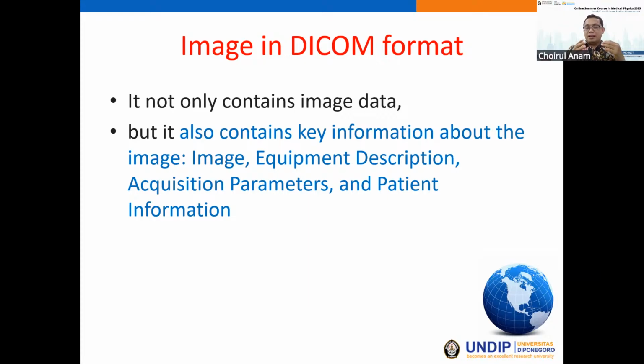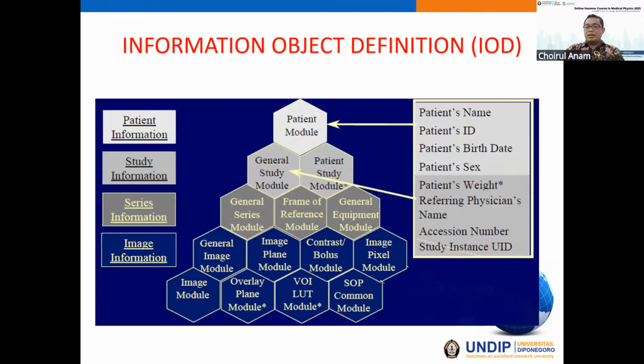So where does the DICOM come from? In the DICOM format, there is information about the object definition.